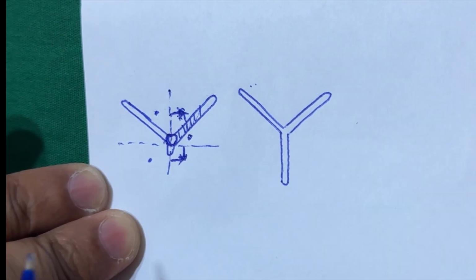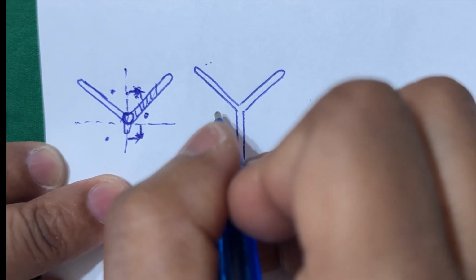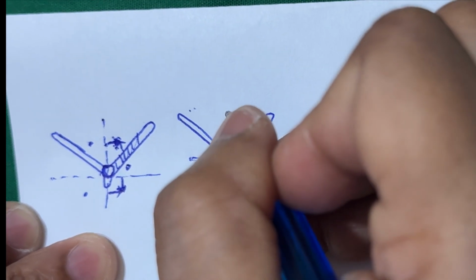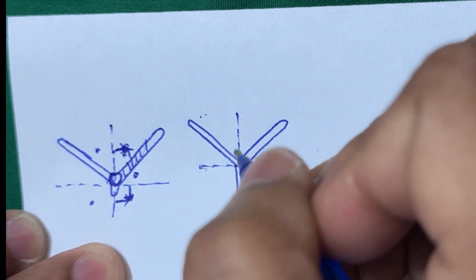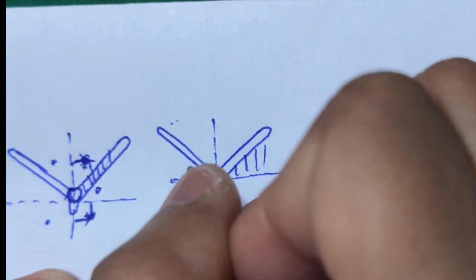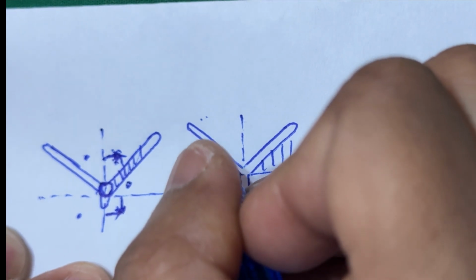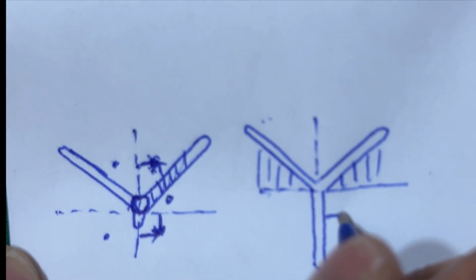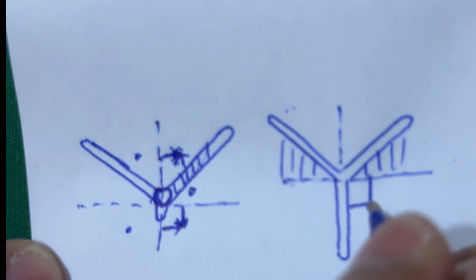Now let us talk about this one. Similarly, let me draw the imaginary line here. Here also we will not take a bite in these areas, nor drive out from these areas. The best thing is to take an x distance from this edge and an x distance from this imaginary line.